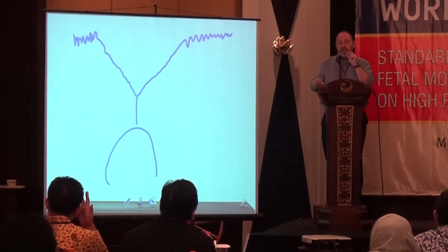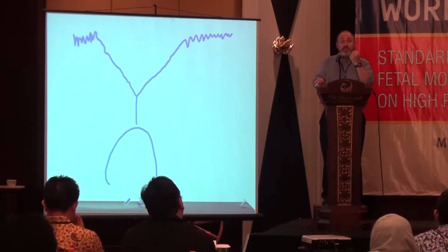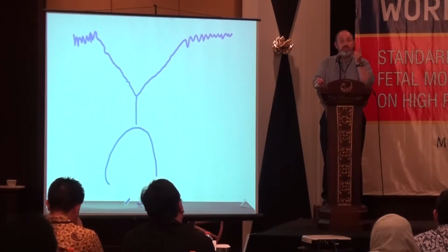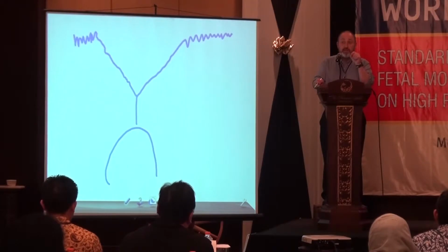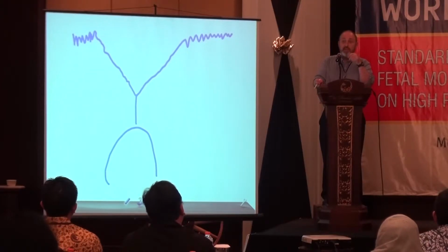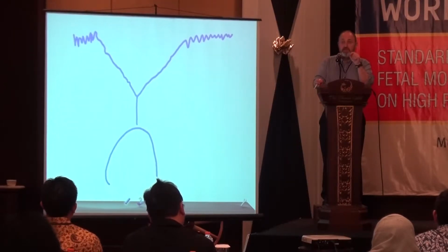As I mentioned earlier, some of the tips I would give you: one is make sure the paper speed is running at the correct speed, 1 centimetre a minute, and check it. Number 2 is to make sure that you are genuinely monitoring a fetal heart and not a maternal tachycardia by mistake, and that's done by checking the maternal pulse. The third major tip for CTG interpretation is that if you have decelerations, ask yourself the question: do they have gradual onset and gradual recovery, yes or no?